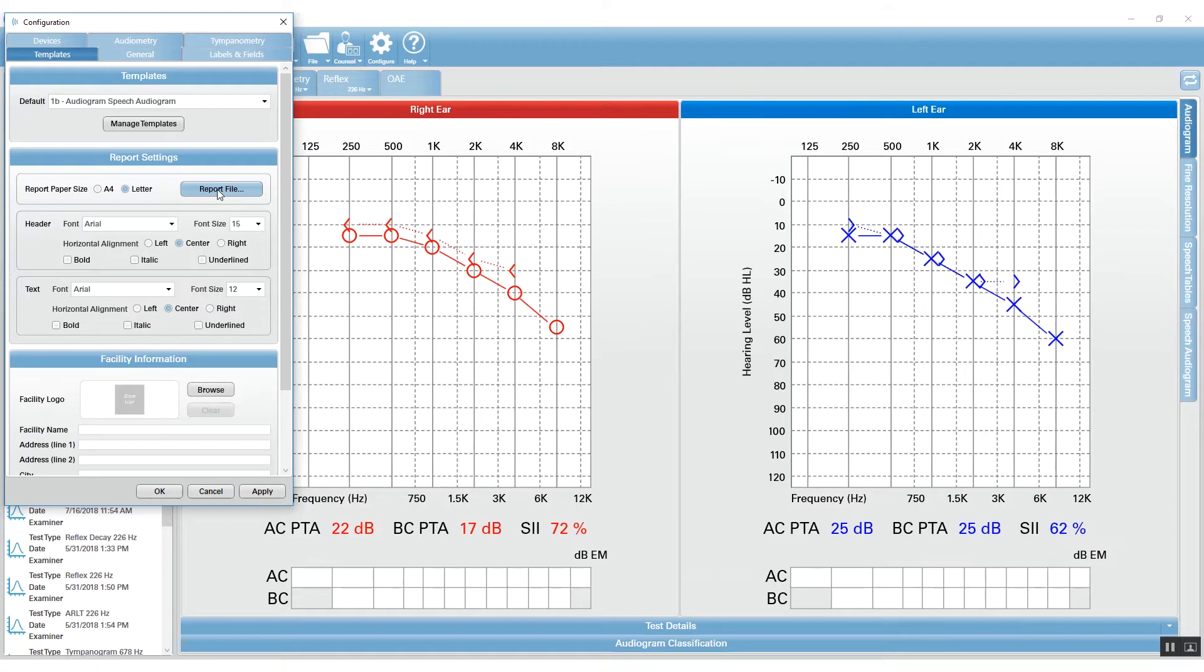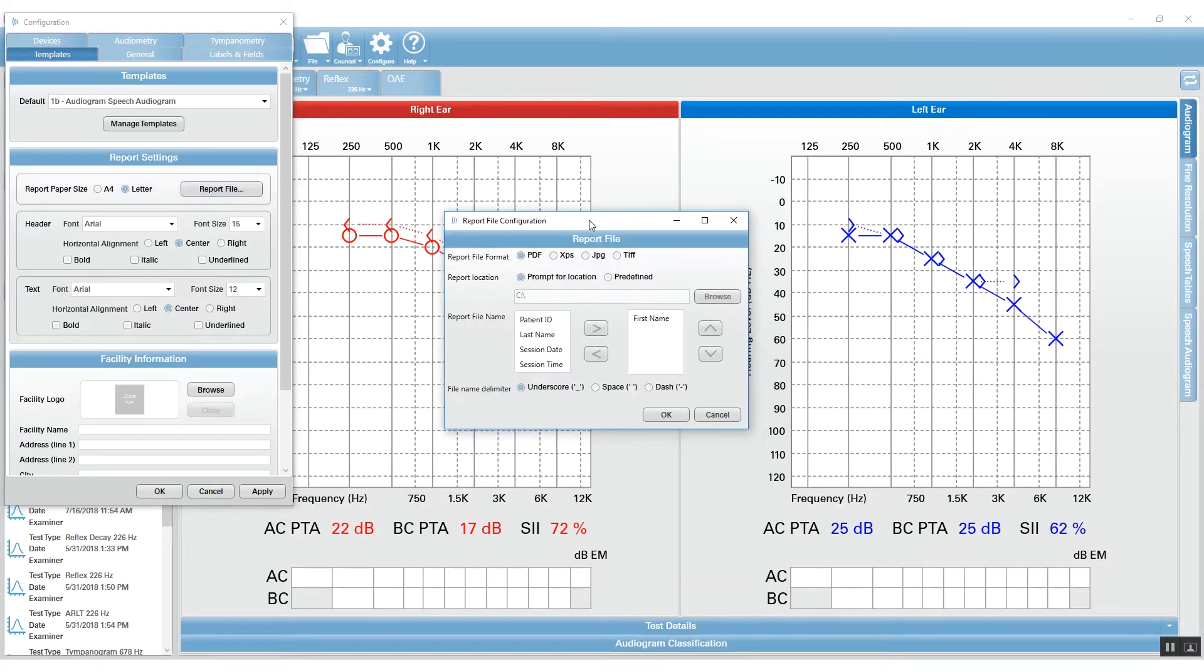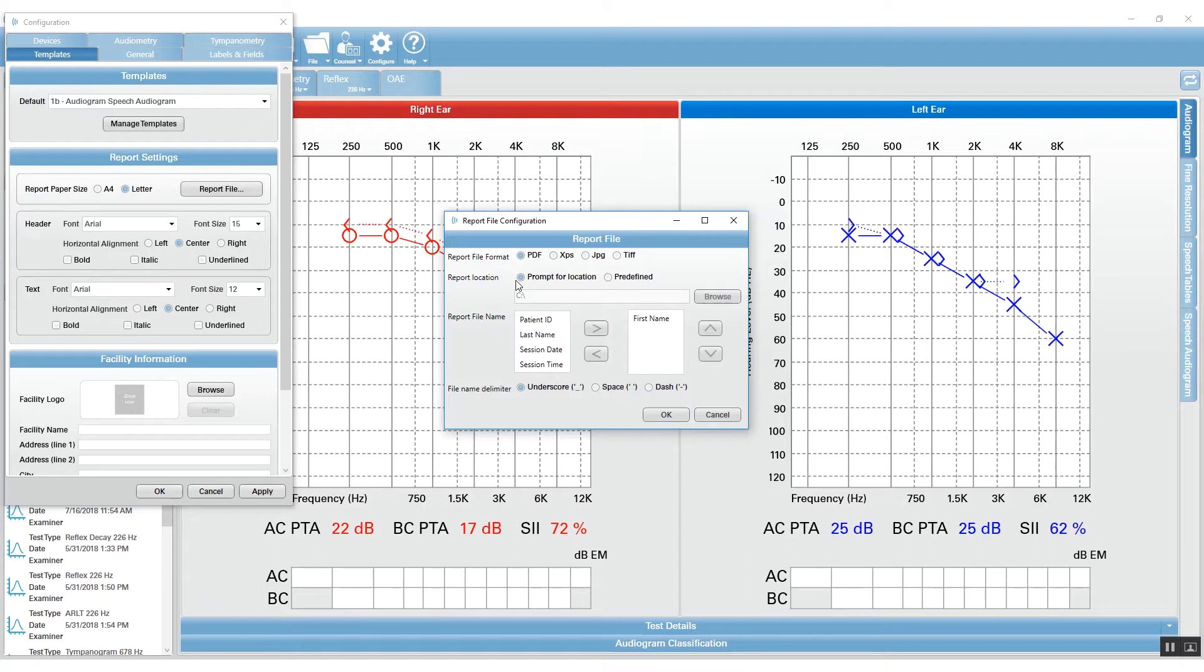You can save the predefined location of this report file. If you click on Report File, it gives you options for the format, the location, and how you want that file to be automatically named.